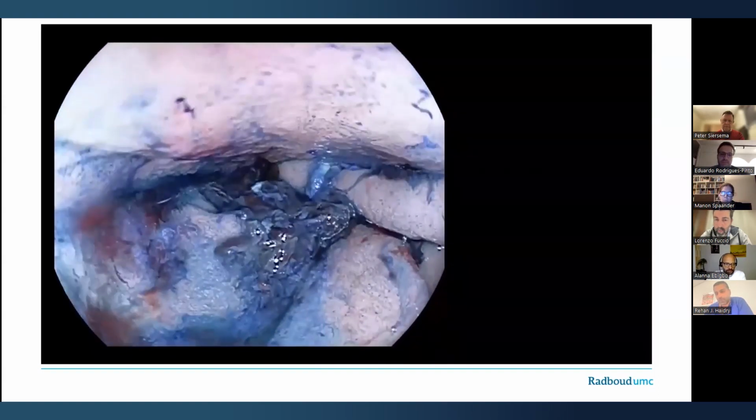So I think that the take-home messages, Peter, from your slide on these defects is that not all holes need to be closed. It's really important to think here a little bit more laterally and think about the three-dimensional space. The mediastinum is a closed system. And actually stenting or closing a defect, if there's a collection, may not be the right thing to do.